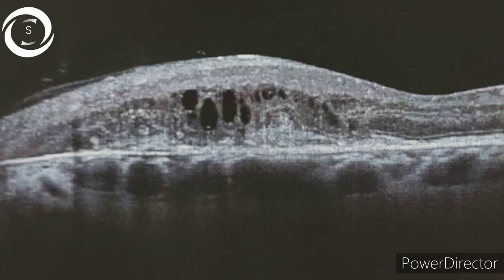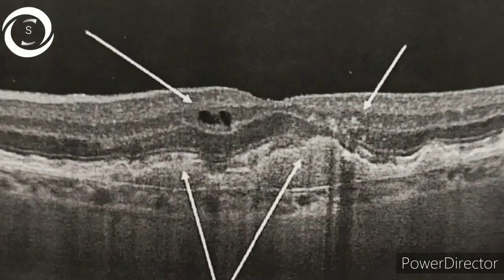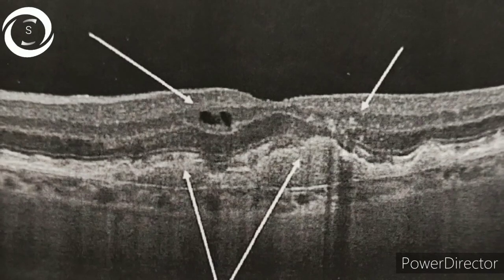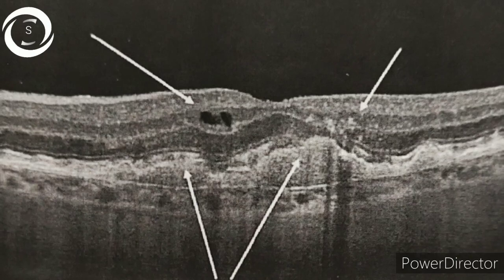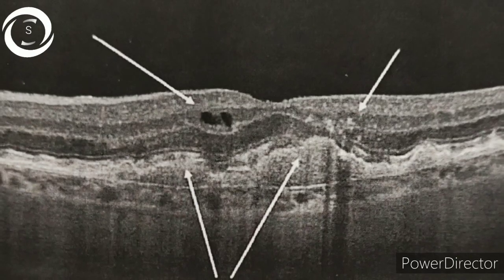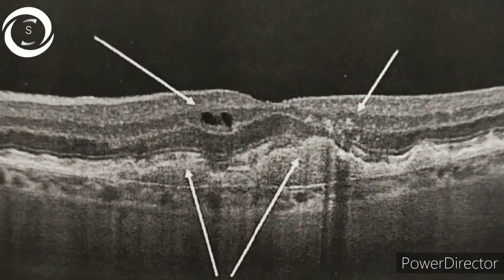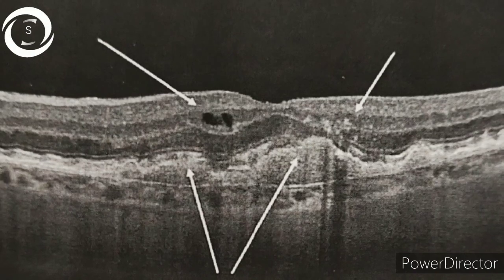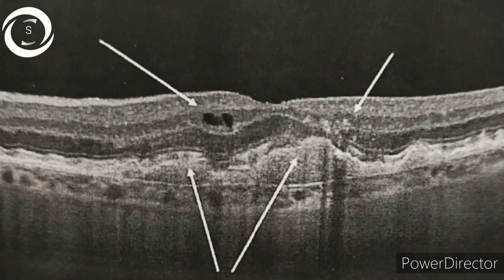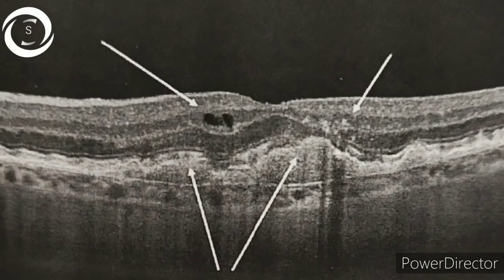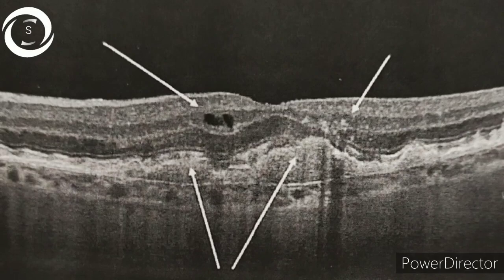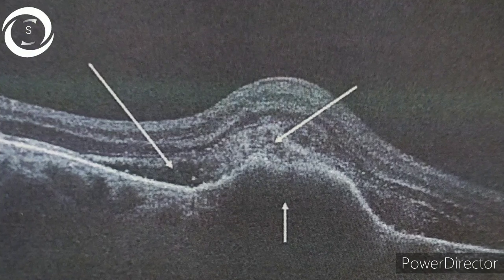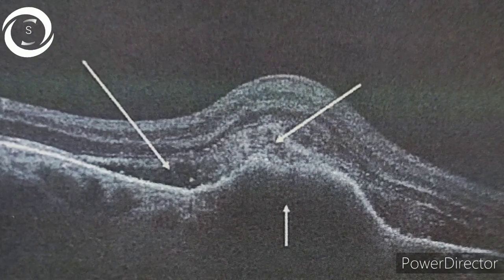In the fourth OCT, you can appreciate the area of hyper-reflectivity in the outer retina overlying pigment epithelium detachment. Intra-retinal cysts are also seen, along with soft drusen. This is the proliferation of abnormal vessels within the retinal tissue, called retinal angiomatosis proliferation, or RAP. This is type 3 CNV, usually associated with exudative AMD.